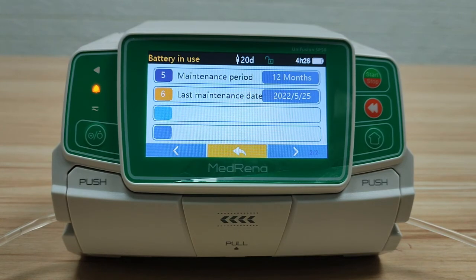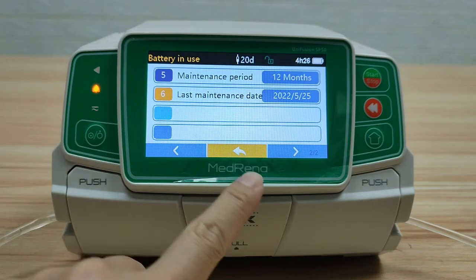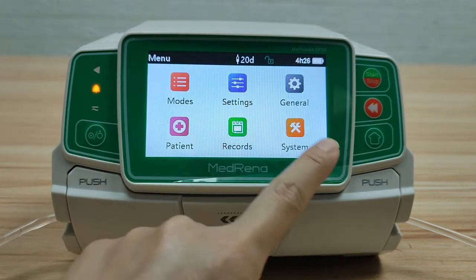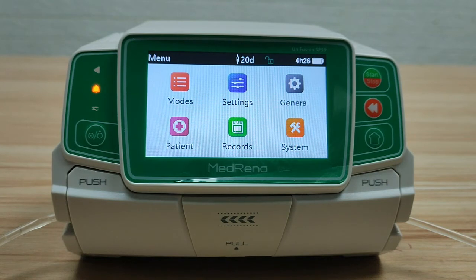Now we have finished the introduction of the various settings of the Medirena infusion pump.